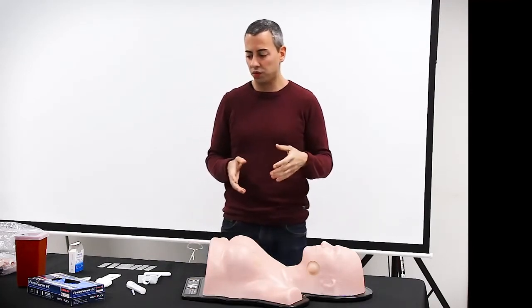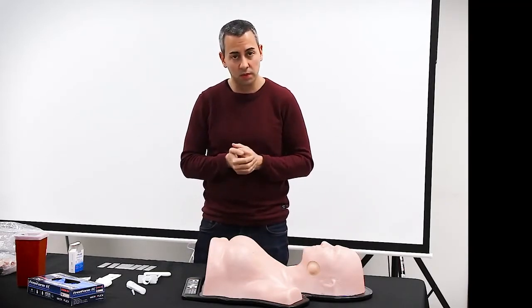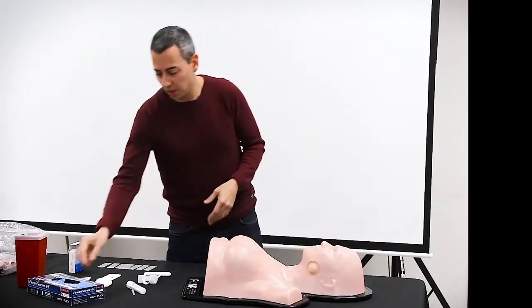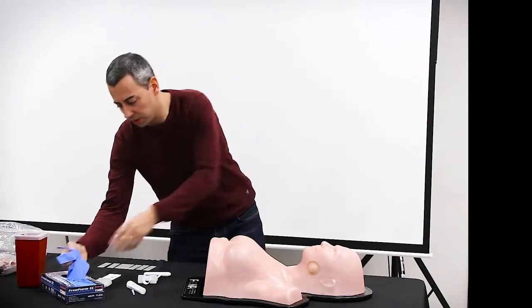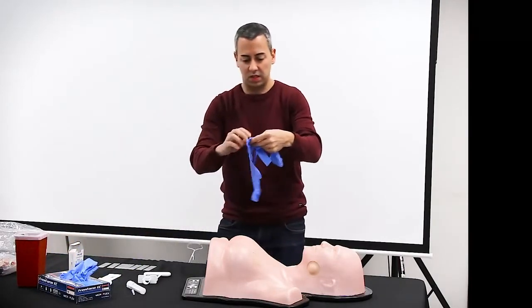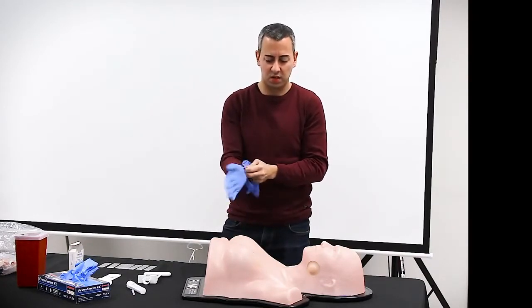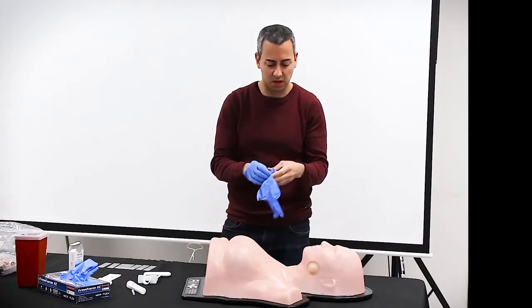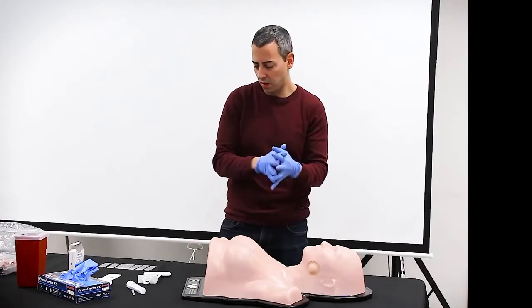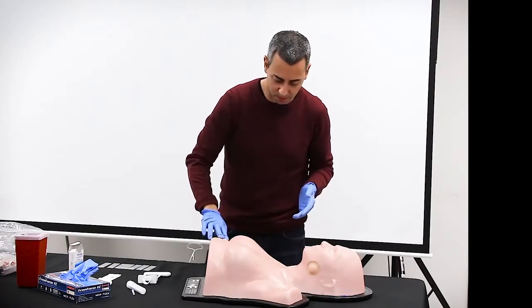Then you have to ask the patient to sign the informed consent form, and then you have to touch. But before you touch, you have to put your gloves on. For the asepsis and antisepsis methodologies, it's not a strict aseptic method. It's not necessary. Just with gloves, then you have to palpate the lesion.